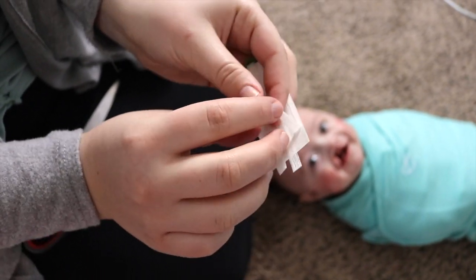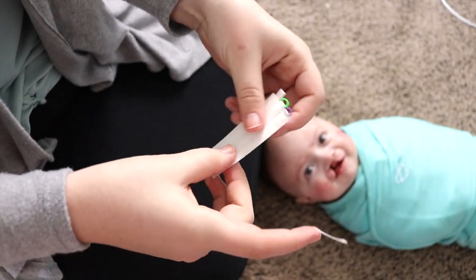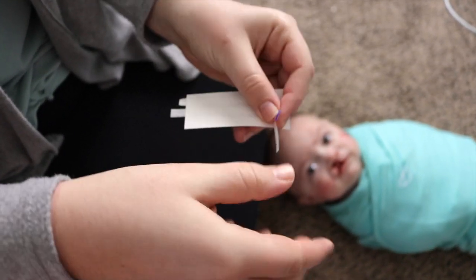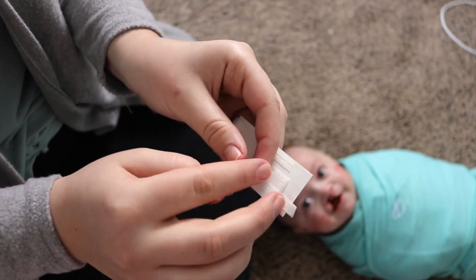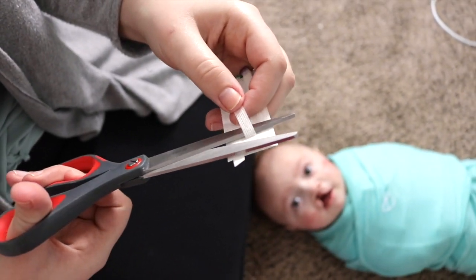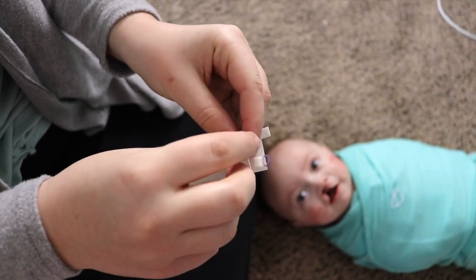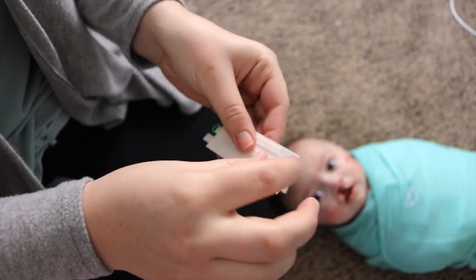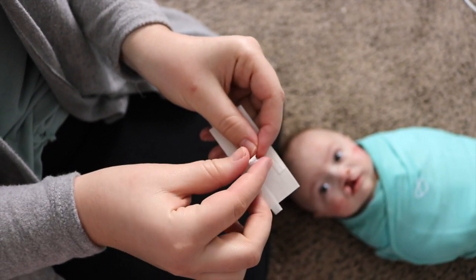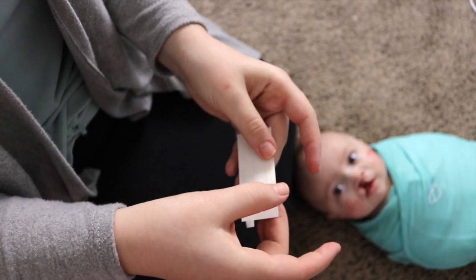Then I remove the opposite side and fold down the other side of the mustache tape so that it creates a long piece of tape. With the other two pieces, I lift up the bottom part of the tape and cut it off, then wrap that around the top near the band to create a reinforcement so he can't pull the band off the tape when he has it in his mouth. I do that to the other piece of tape as well.